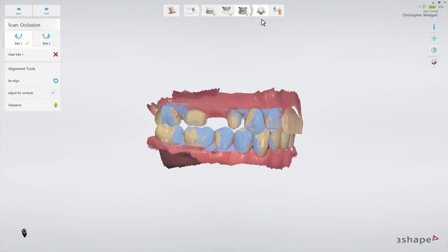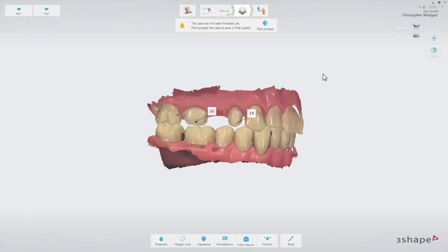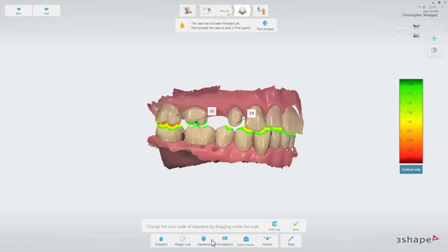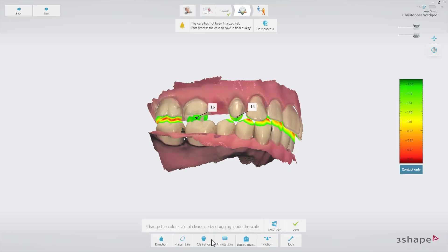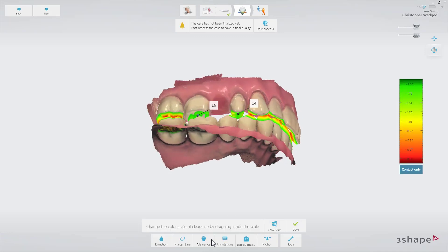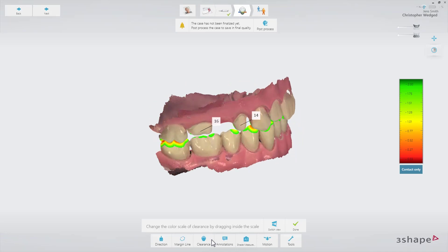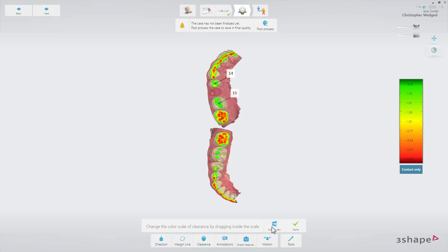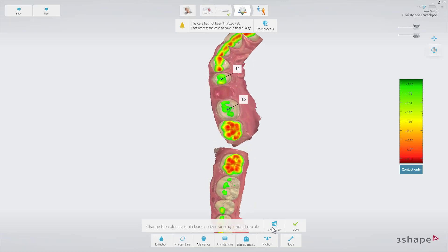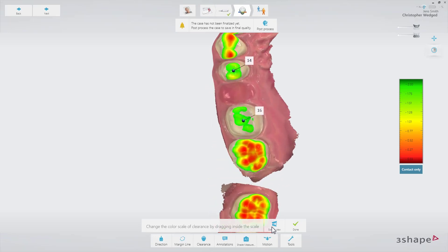Go to the analyze page and confirm that there is enough space for the reconstruction between the upper and lower jaw, using the clearance tool. Optionally, set the margin line. You can also add some comments on the 3D scan using the annotation tool.